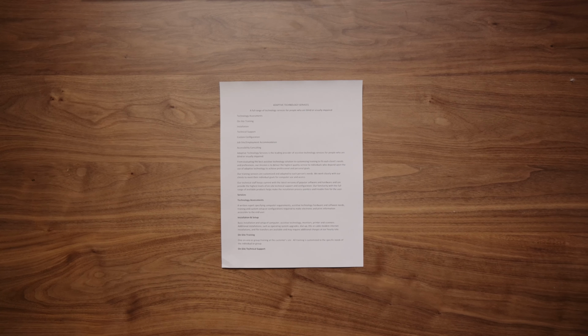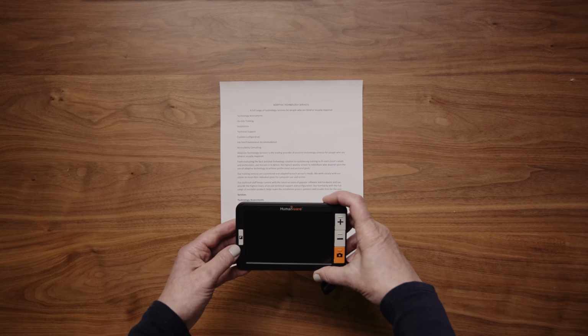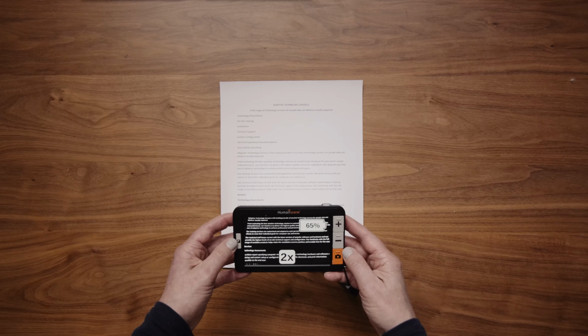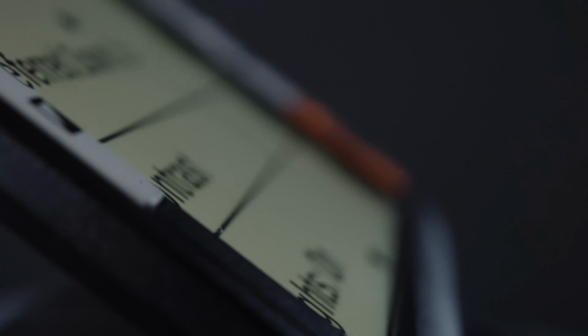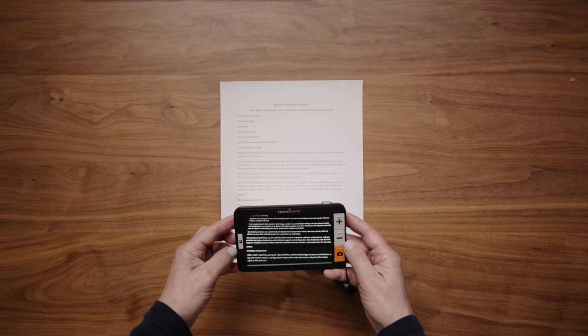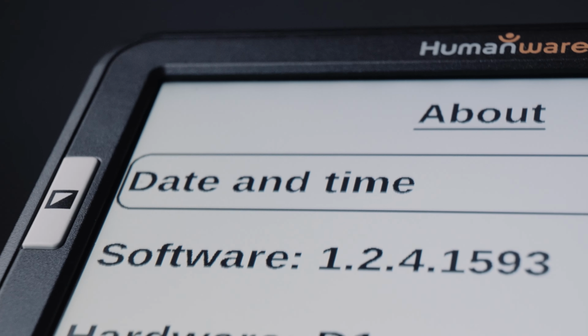The Explorer 5 settings. The Explorer 5 has a configuration settings menu. Use this menu to change your preferences. For example, you might want to add or remove color contrast schemes, adjust the brightness level, or set the date and time. Use the instructions below to navigate the settings menu. 1.